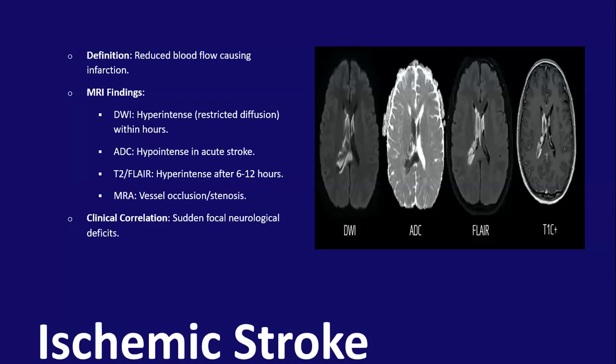You would see a patient, for example, presenting with the middle cerebral artery segment at M1, and you would see the deficit would be much more prominent. If it's in the left hemisphere, they would probably present with maybe speech abnormalities, with limb weakness, with convulsions, etc., etc. So MRA would help you find out your MRI findings. Next slide, please.